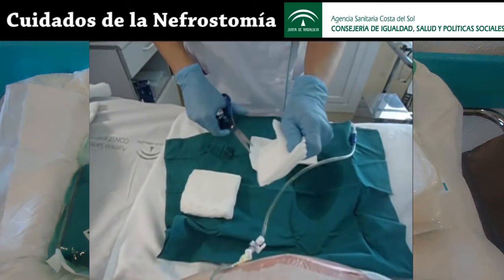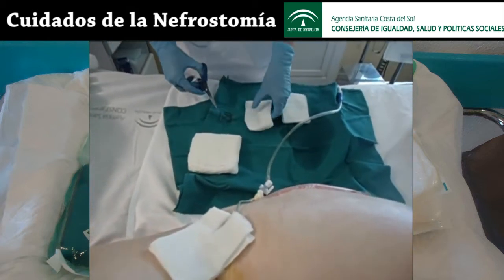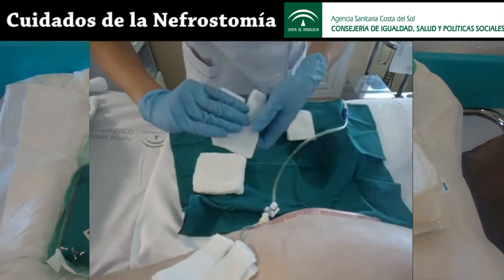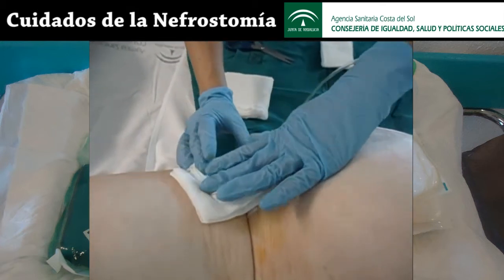Take a whole gauze pad pack and cut a slit from the outside edge to the centre of the pads. Take another gauze pad pack and cut another slit from the outside edge to the centre. Fit the gauze pad around the nephrostomy tube to secure it.